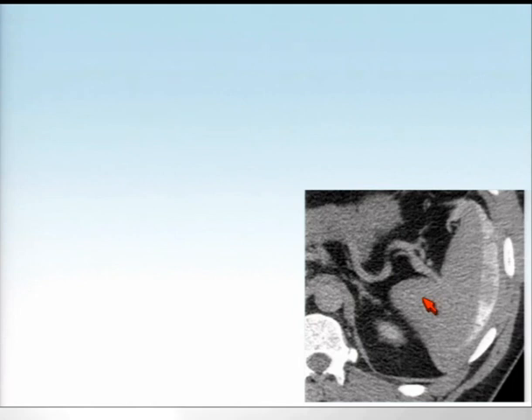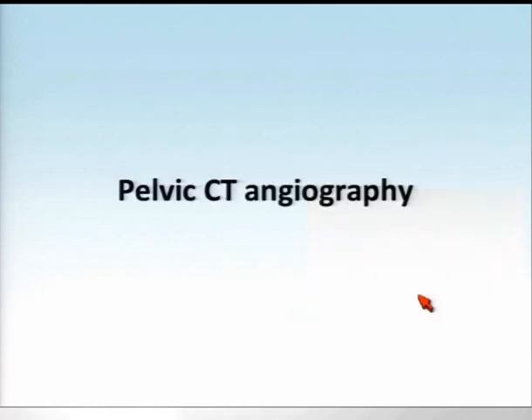And as far as any good evidence for added value of any other organs in the abdomen, to my knowledge, there isn't any, but we're getting those for free if we're going to decide to image through the spleen. So that's something you should consider. There is some evidence to suggest that there is added value of that practice.